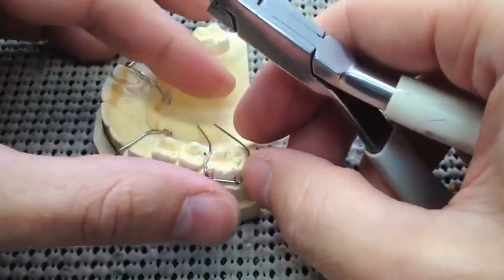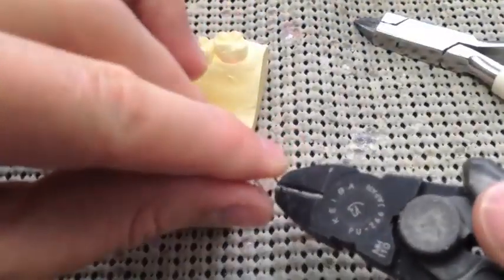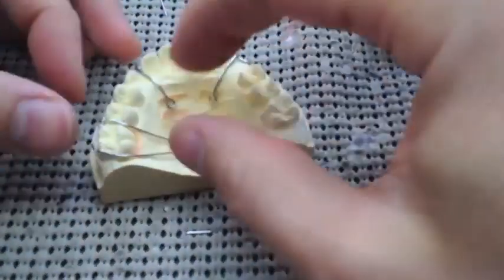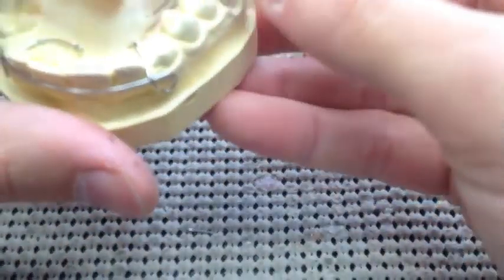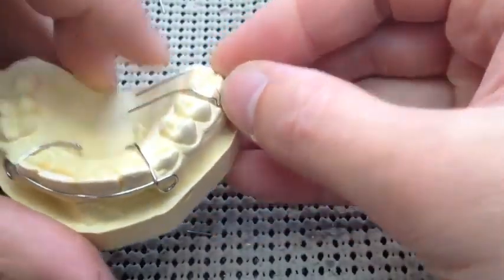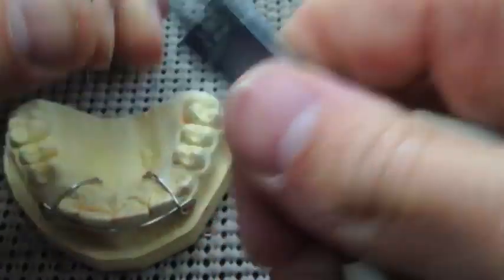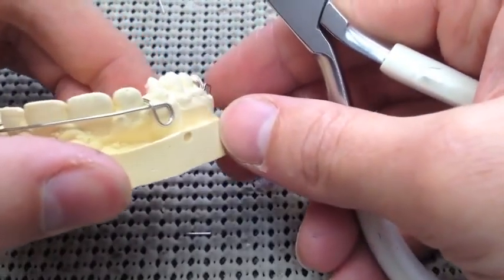I usually make horseshoe-shaped acrylic palates, so I like these a little on the short side. I don't like them going all the way to the top of the palate — I like them curving forward, so you'll see me bend it forward later. The important thing is always put your Adams clasp in the same spot every time before you make a bend on these tag parts that go into the acrylic. That way you don't bend it and then realize you didn't put it in the right place.